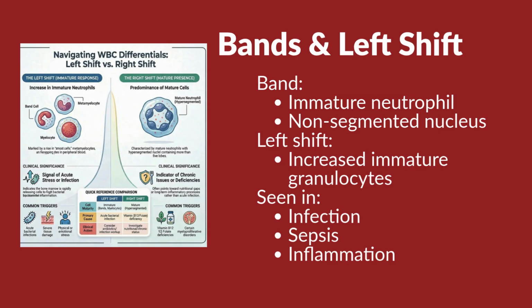Blasts have blast nuclei in very immature cells. Think leukemia and malignancies. Not an infection, but something more severe when you see blasts.